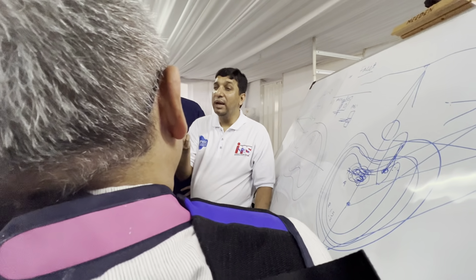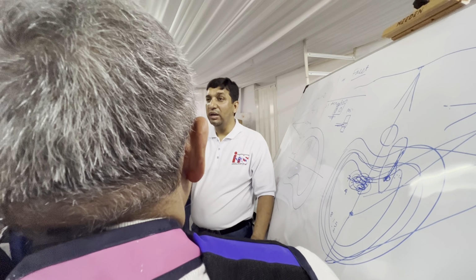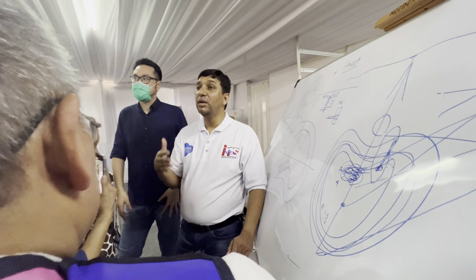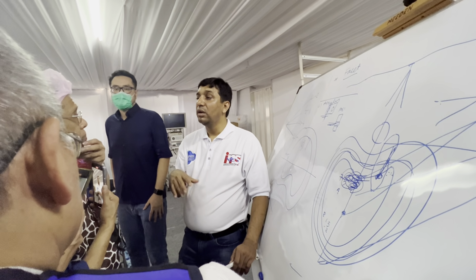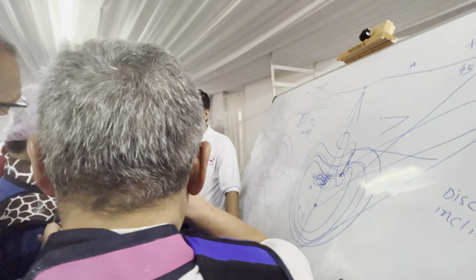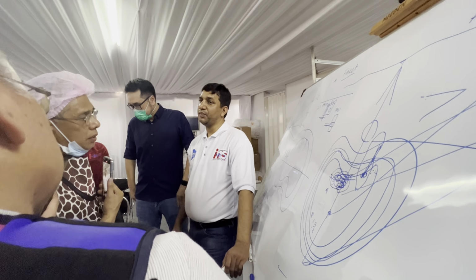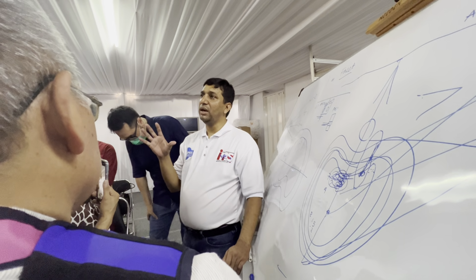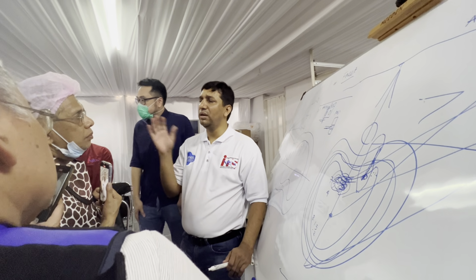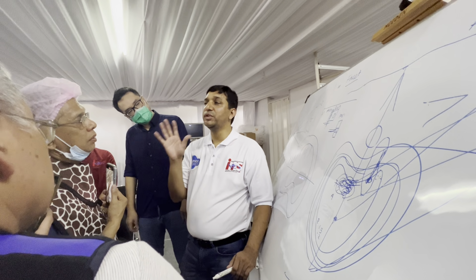And by chance, if you have made some mistake and there is a minor dural injury or dural leak, it will seal it because it has regenerating possibility. If you take 15 ml of blood, it will give you this much. So you hold it and put it through the sleeve. Our philosophy is that any kind of disc herniation, central, up, down, migrated, extruded, we can do with the transforaminal approach because it's the safest way.